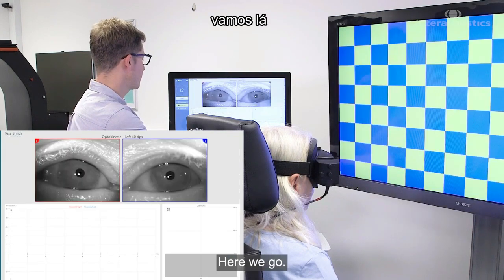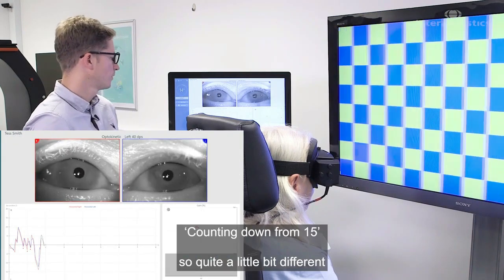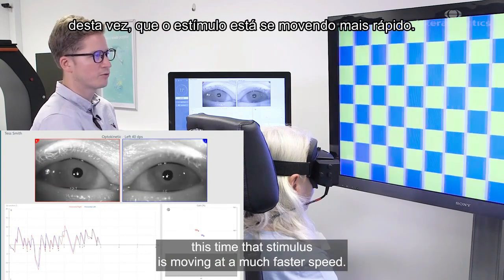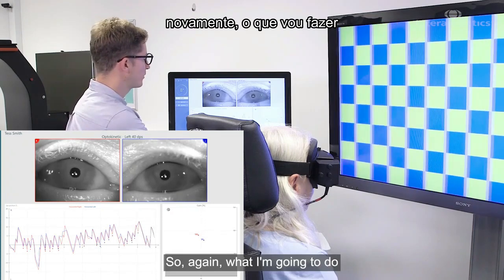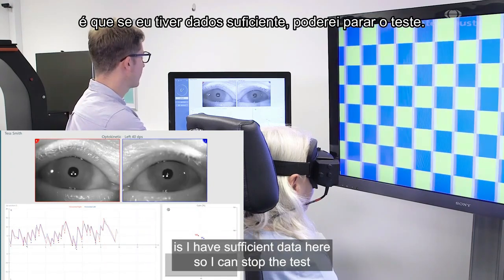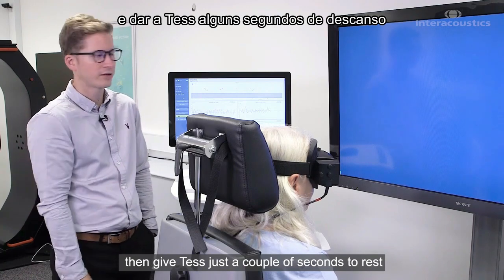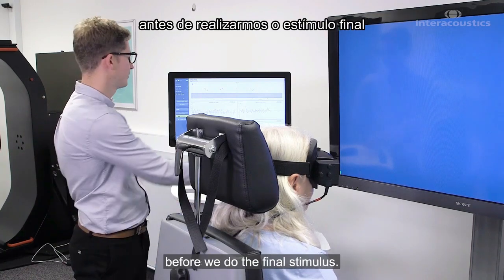The stimulus is moving at a much faster speed now. I have sufficient data here, so I can stop the test and give Tess just a couple of seconds to rest before we do the final stimulus.